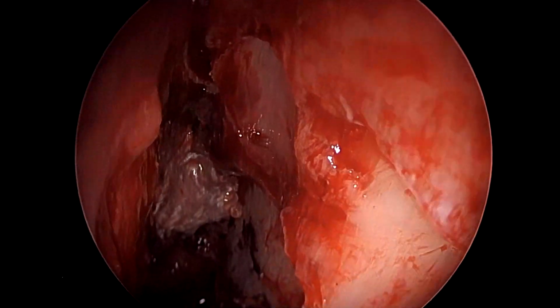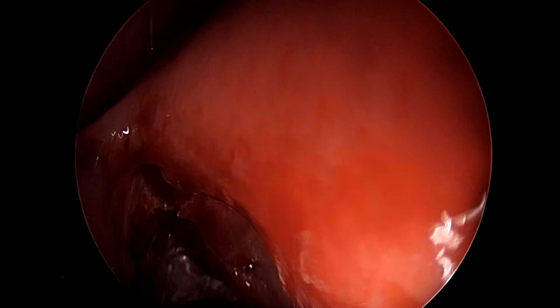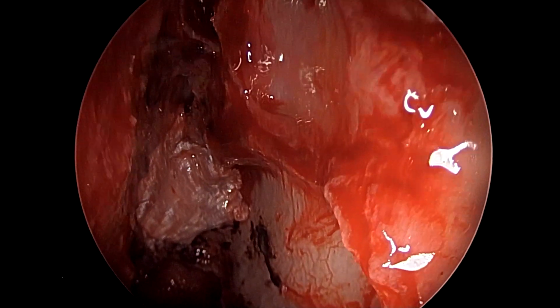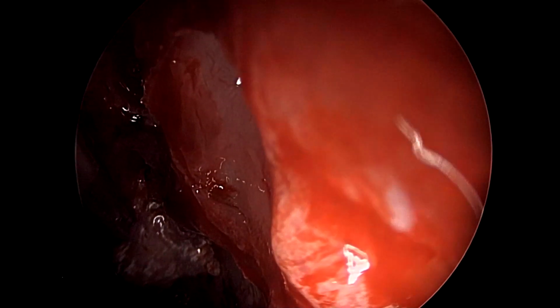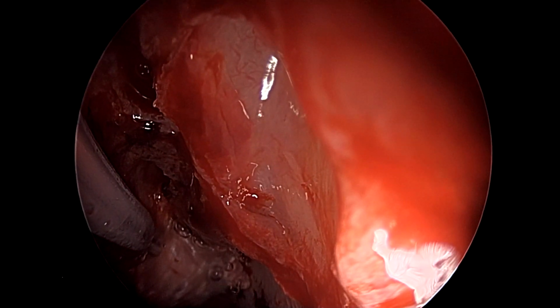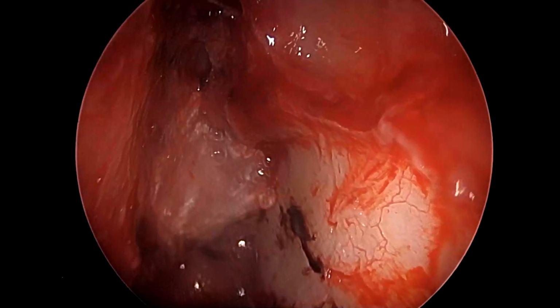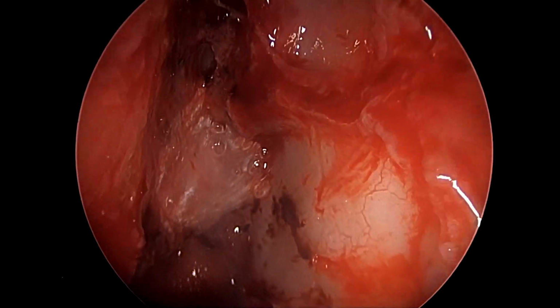So using 2 layers for such smallish defects is a reasonably good approach, and we normally use only these 2 layers. The second layer, which we have used as an overlay, could also be replaced by a free mucosal graft. We use that when we plug the defect of the cribriform plate. But here, since we maintained the middle turbinate and did not resect it, we preferred using another fascia graft over the first one. The 3-layer fascia graft is one underlay, above the dura, the other inlay on the dura, and the other overlay.